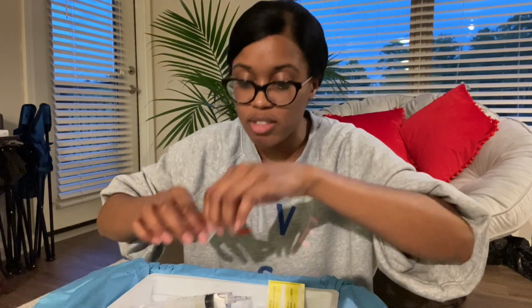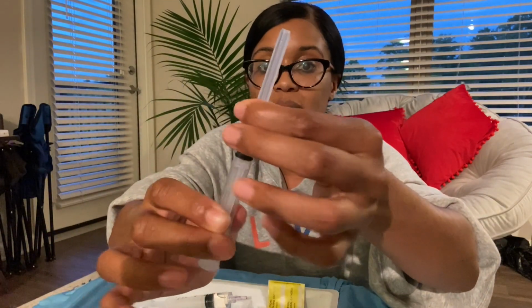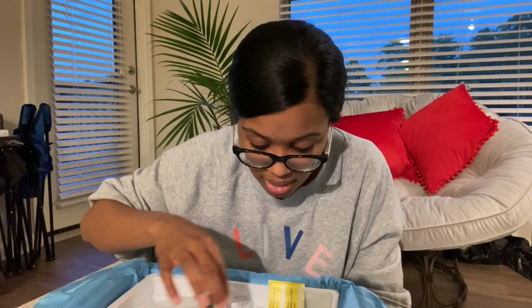And then what else is in here? A little tiny syringe and a little tiny needle that we use to inject the local anesthetic to numb the patient's back.